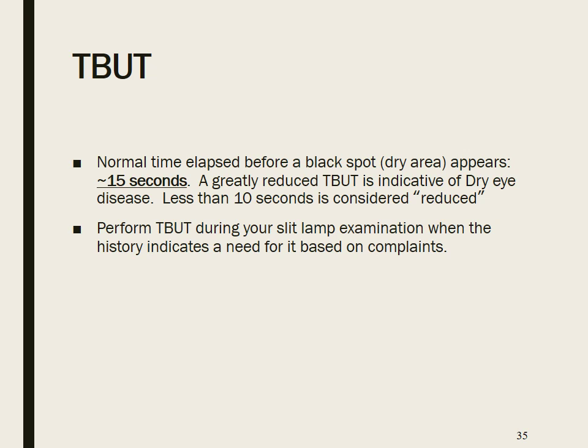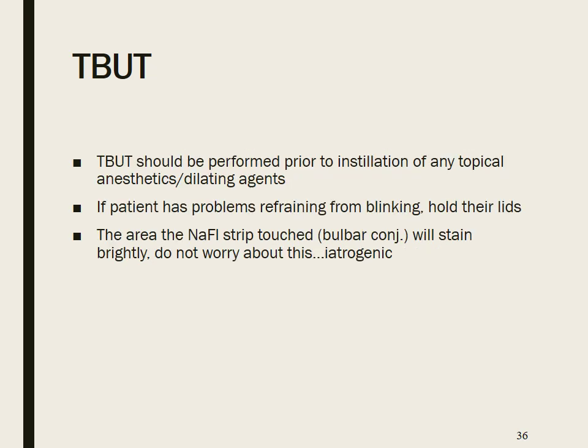Please perform TBUT during your slit lamp examination when the history indicates a need for it based on the complaint. TBUT should be performed prior to instillation of any topical anesthetic or dilating agent. If patients have problems refraining from blinking, hold their lid. The area the fluorescein strip touches, which is the bulbar conjunctiva, will stain brightly, but do not worry about this.